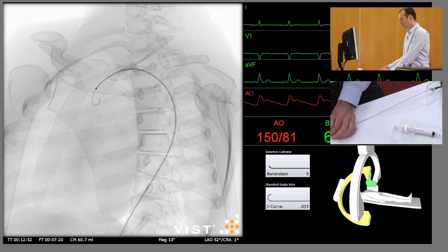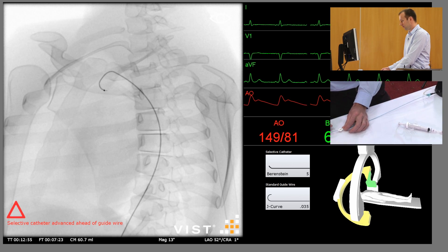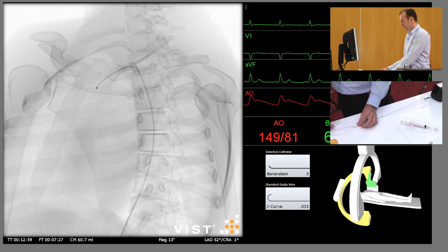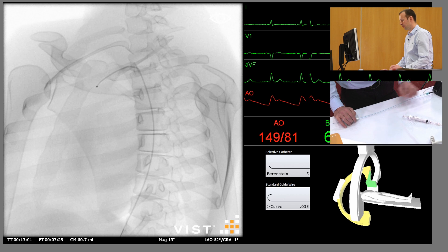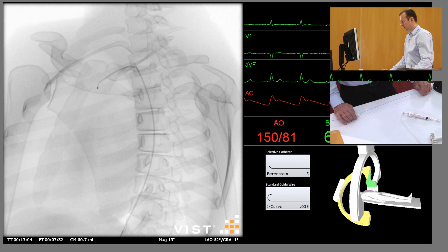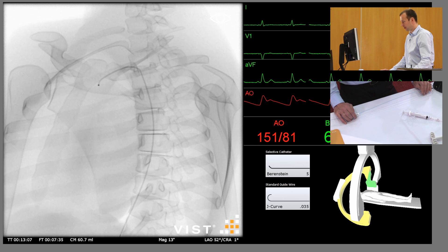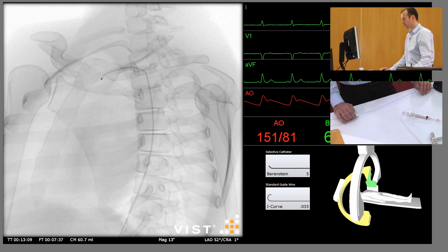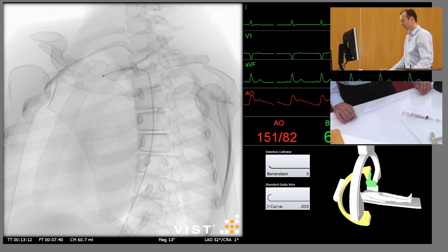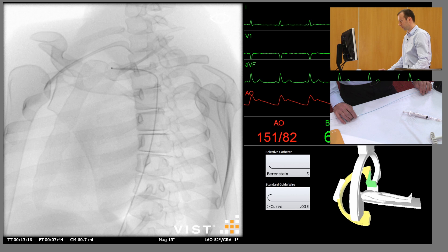At this stage we pull the guide wire back into the catheter, let the catheter take up its shape. You can see the simple shape of this catheter with just a little curve at the tip. As we withdraw it, getting close to the origin, we're just going to rotate it through 180 degrees until it falls in.